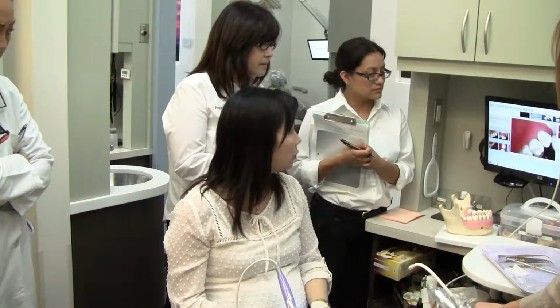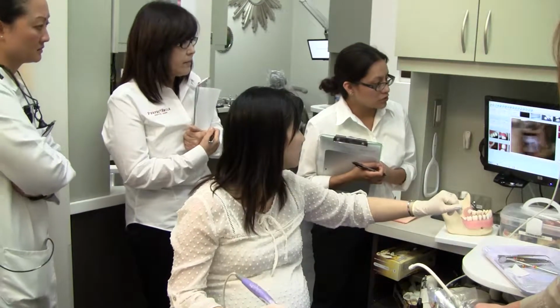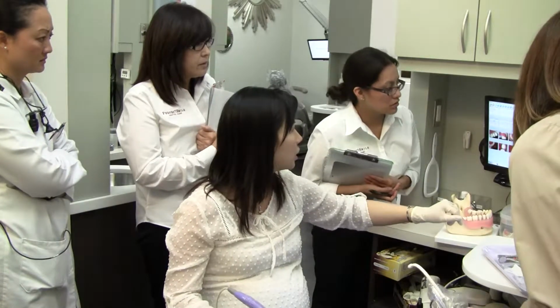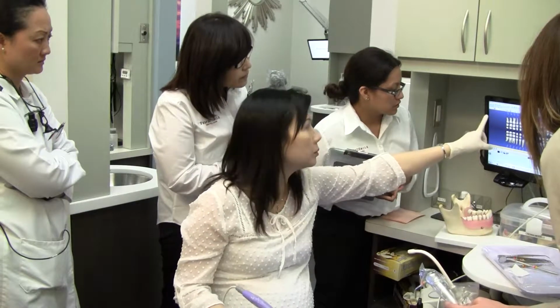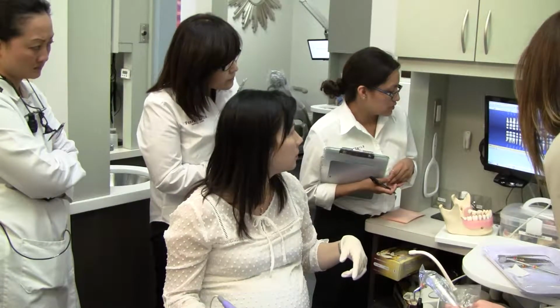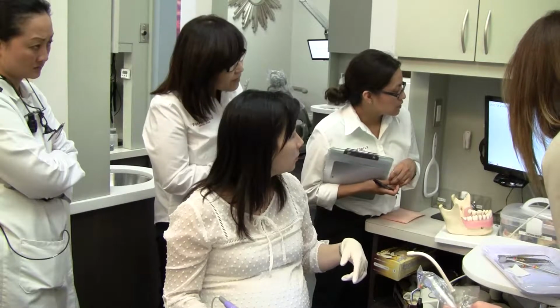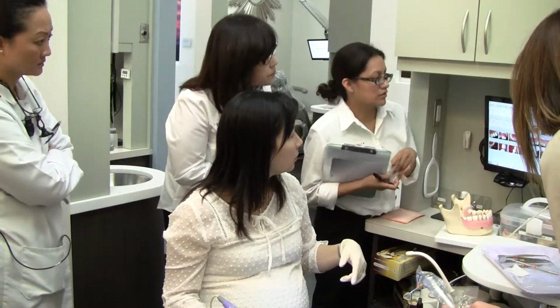So, do you remember how to get to this screen? I'm not really used to the other way, but she said there's a new way. What is the new way? They used to do the little point. Through the camera here now? Yeah, so you go through the camera, you click right here. Then you have to make sure it's on the tooth, and then you go right here, and it comes up.